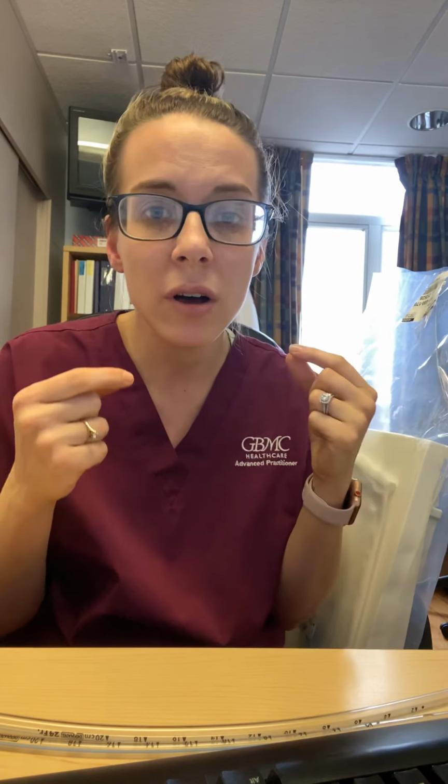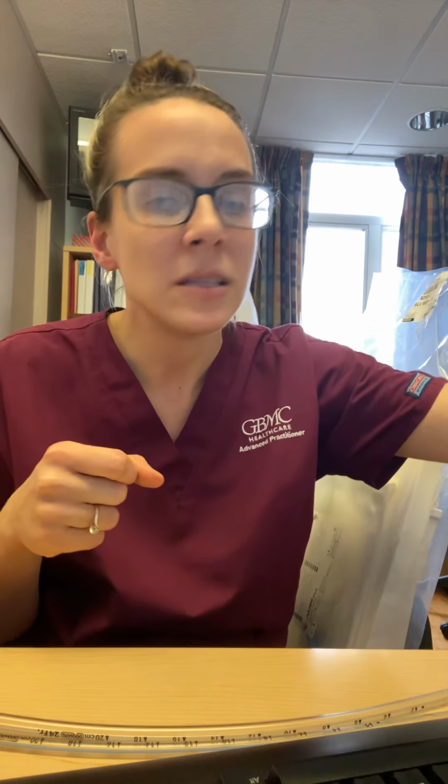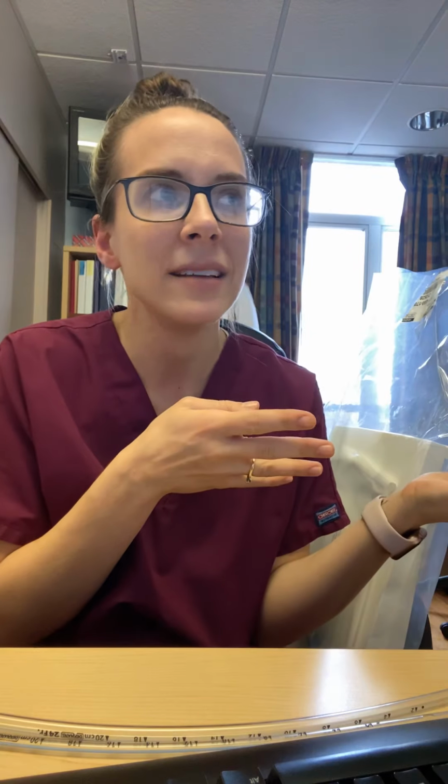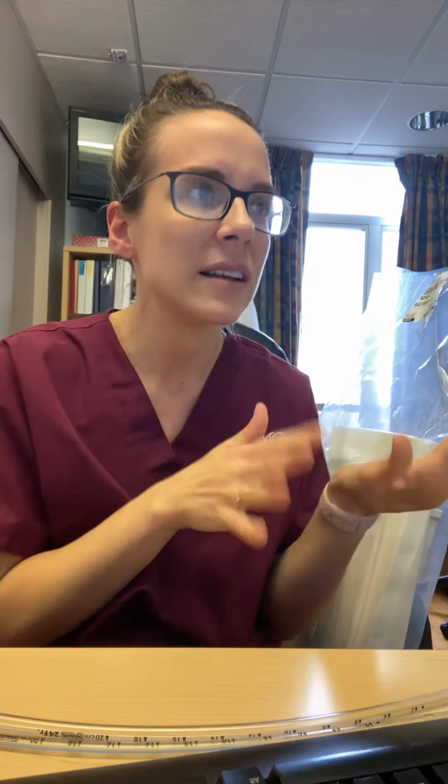If that Pleur-evac gets knocked over, that water column could transfer to the water seal column and it could mess up your readings. And also if you have an air leak, I talked about the bubbling in the water seal chamber, that can get transmitted into the suction column. So it's just not the ideal system. I just wanted to let you know that it's out there in case somebody asks, is this dry suction or wet suction? They probably won't, but just letting you know that's what it is.